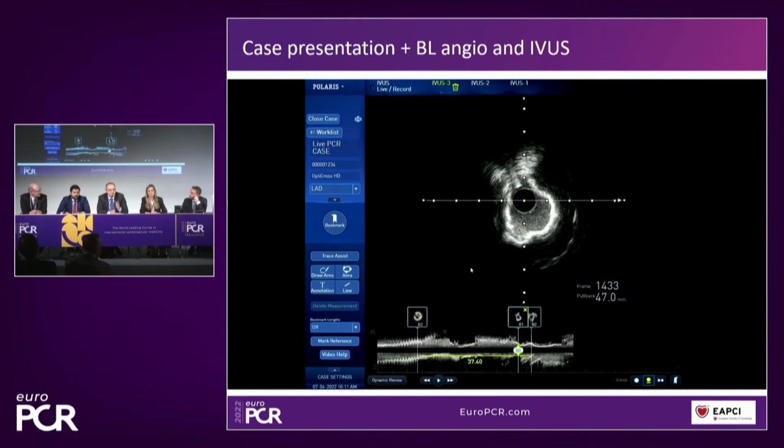Valeria, in your practice, you have this IVUS information. If you have to use IVL, what are the key pieces of information you would extract from IVUS to guide your Shockwave balloon size selection? Well, what's important to consider is that you have to aim for a 1-to-1 ratio, so 1-to-1 balloon size and diameter you want to achieve. So if you don't have a good estimation of the actual size of the vessel, you are likely to undersize your IVL balloon.